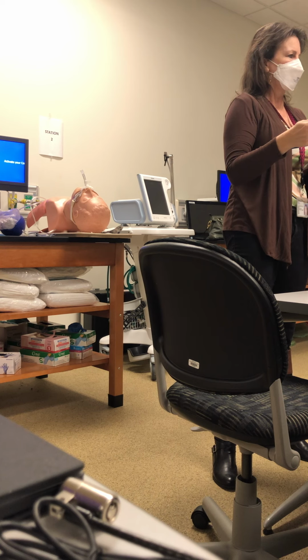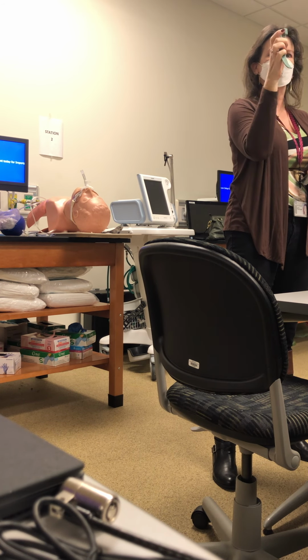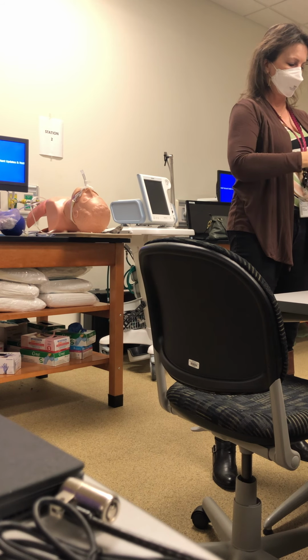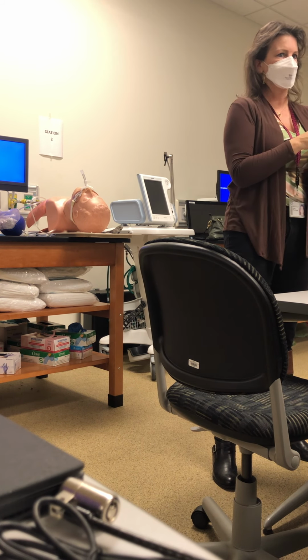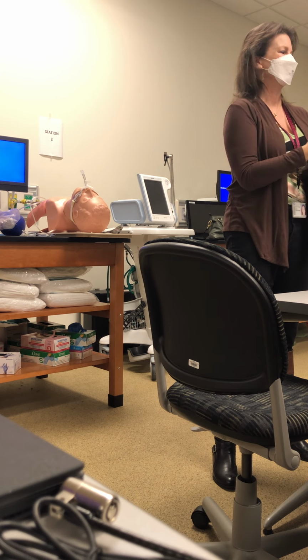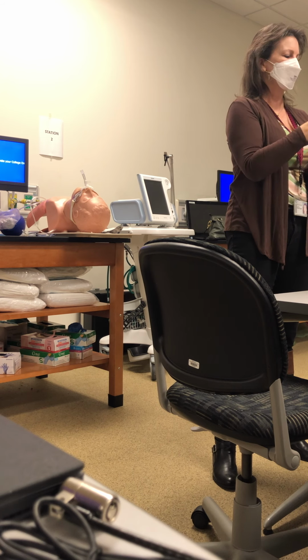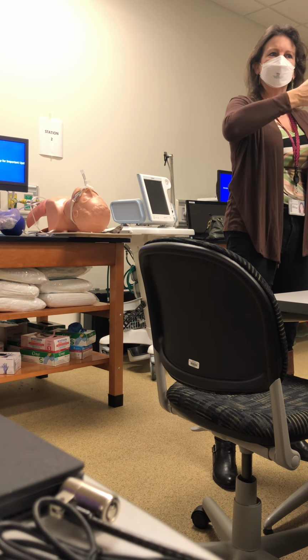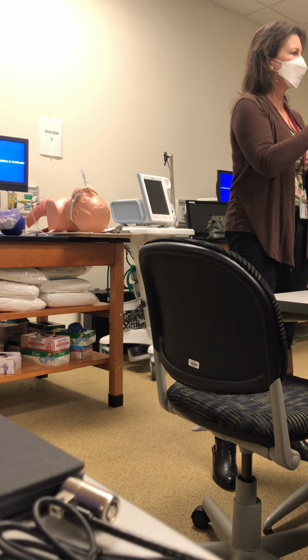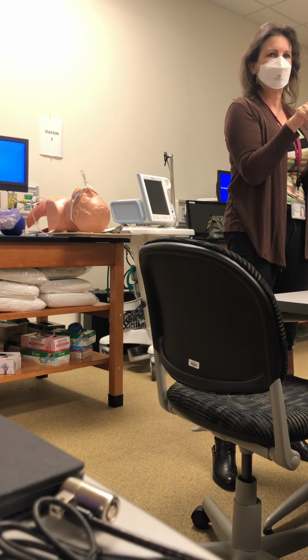Okay? So when you go to set it up, there's a little lip there that you're gonna put in here, push, and then your light comes on. Okay, so it's in place. I'm gonna have each one of you do it. If the light doesn't come on, we have older blades where you could try to screw that light bulb in better. These are disposable blades, so you don't have to do that.